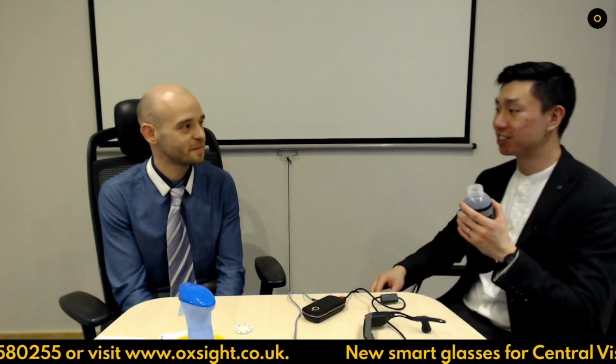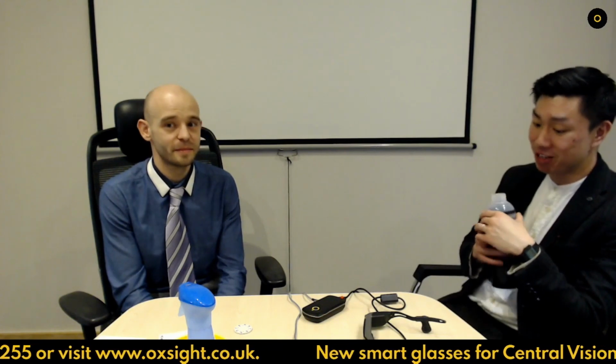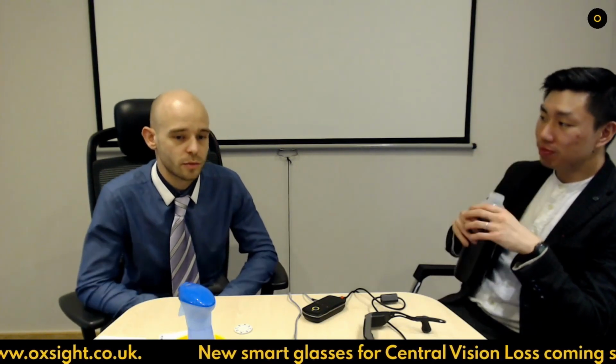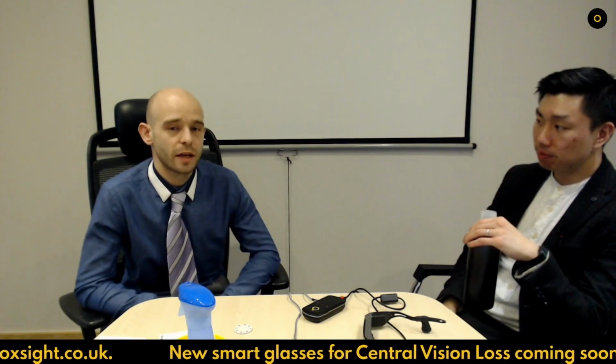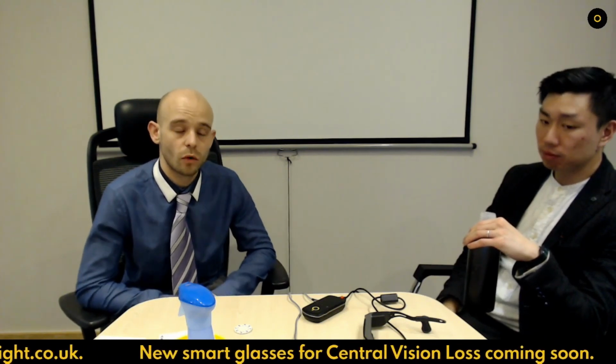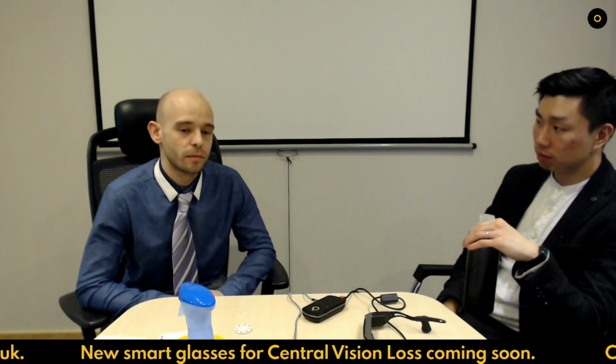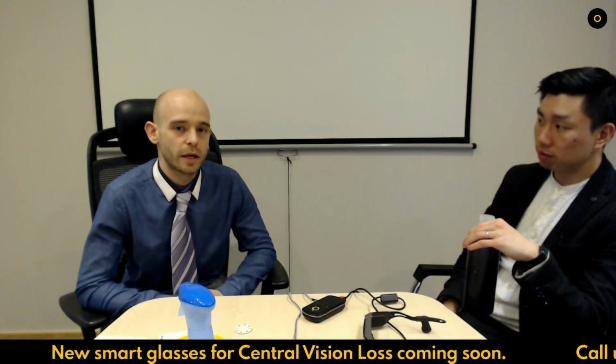Definitely don't believe those people who are attempting to convince you that an external machine can actually physically make you better. At least at this point in time, I don't think it's possible. Who knows what technology will hold for the future, but at this moment in time, the glasses are purely there to try and work with what remaining vision you have left. So we certainly won't make bold claims like that.